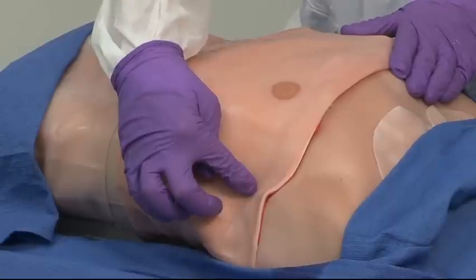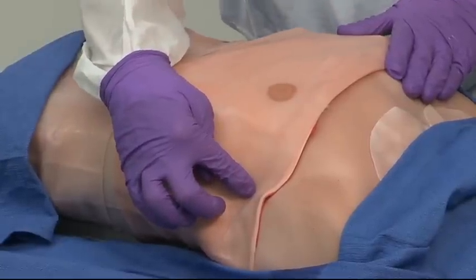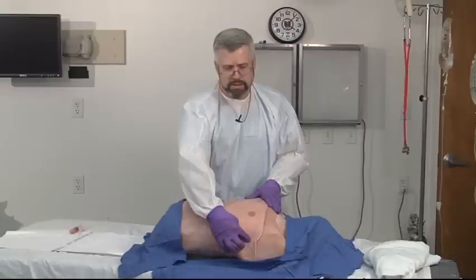If the patient is moribund or comatose, you probably don't need to use local anesthesia, but it's probably a good idea to use local anesthesia in patients who are otherwise conscious.